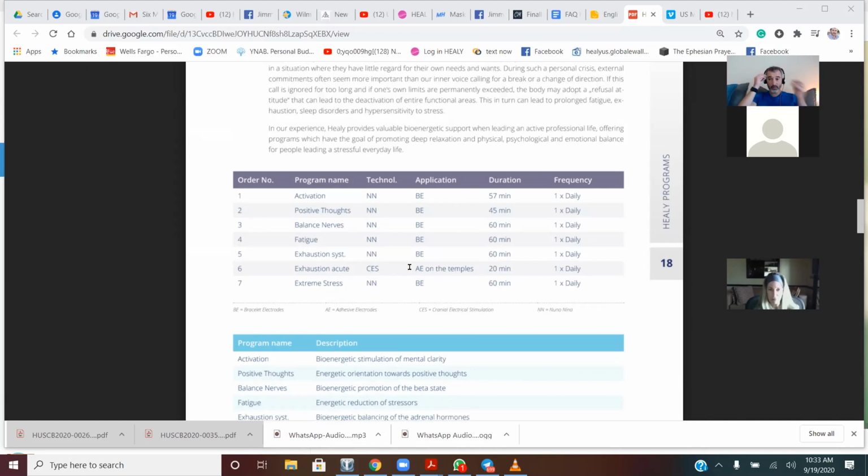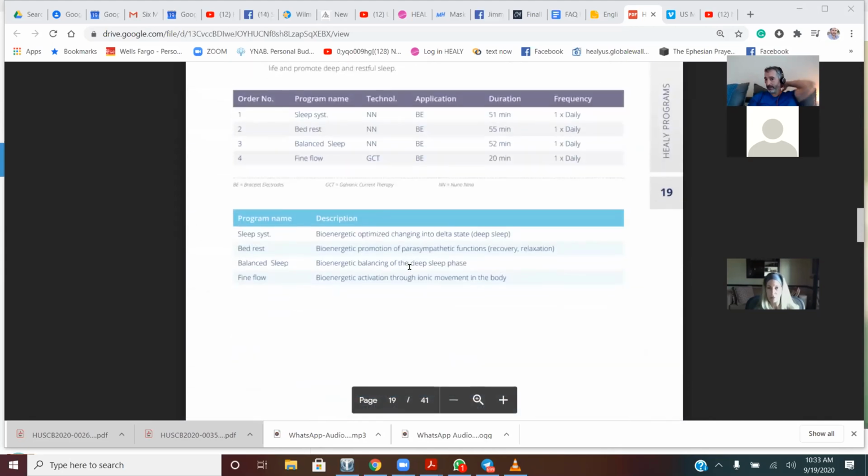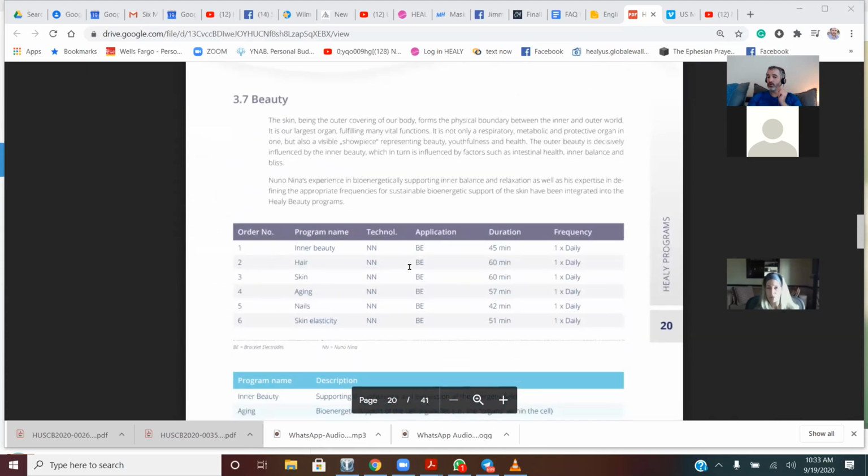How would you do that? You do that with sticky pads. But if you're in the US and you have a US manual and a US version of the Healy Pink app, it's not going to tell you to put it on your temples because the FDA doesn't allow you to do that. Does that make sense? So anytime you see the Pink app giving you recommendations on the upper back, you can ask yourself whether you'd be better off with ear clips or with sticky pads.